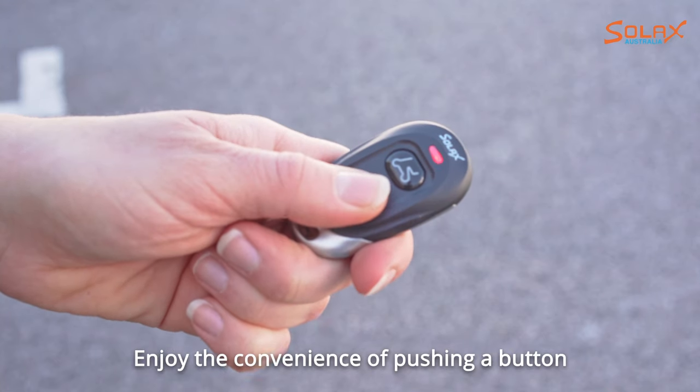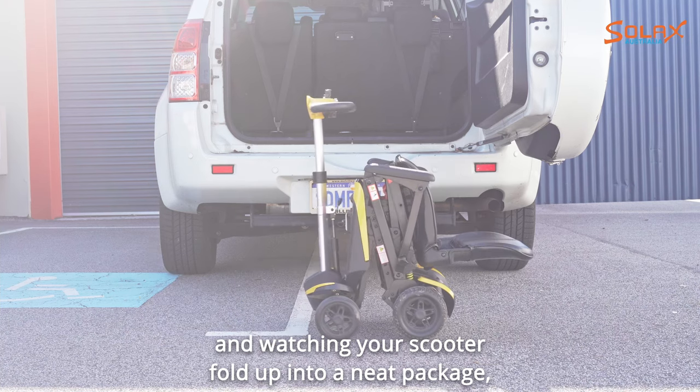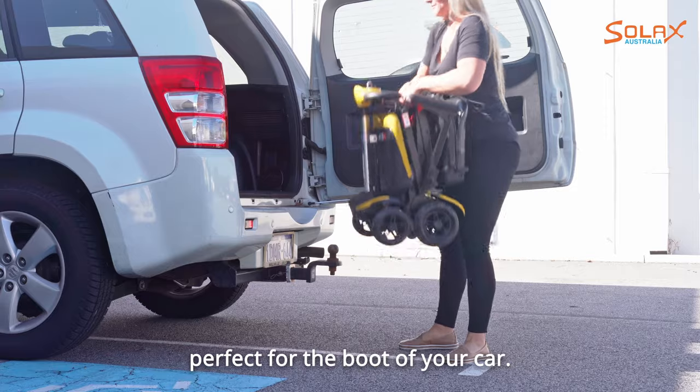Enjoy the convenience of pushing a button and watching your scooter fold up into a neat package, perfect for the boot of your car.